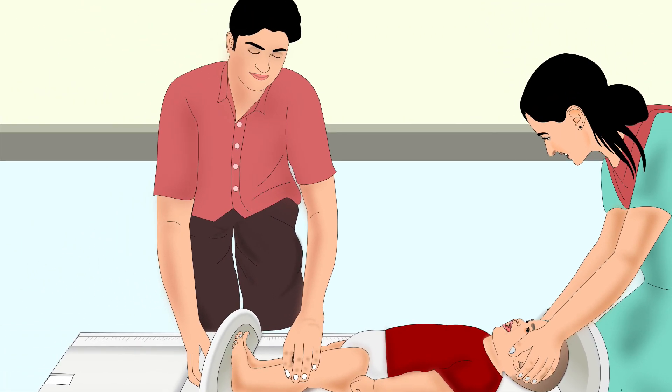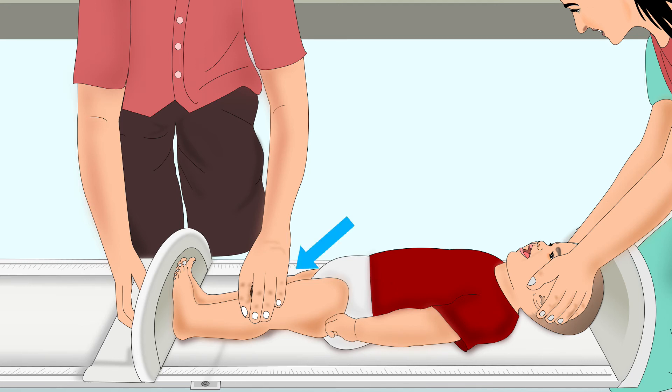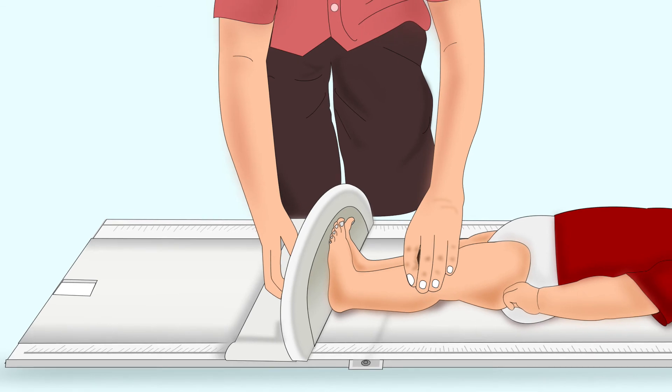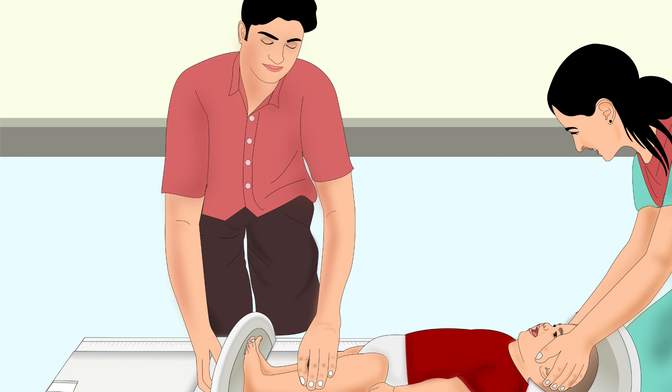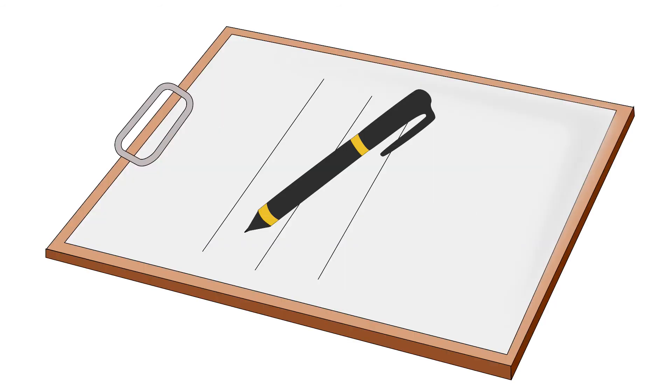The second person should position himself near the foot piece. He should straighten the child's legs, holding the knees firmly on the board with one hand, and with the other hand move the foot piece until it presses against the heels of the child. He must not tilt the foot piece. The child should lay completely flat on the height board. The person holding the foot piece should read the length, keeping his eyes straight above the measuring tape. Length can be read up to 1 mm of accuracy. He must write down the length immediately.